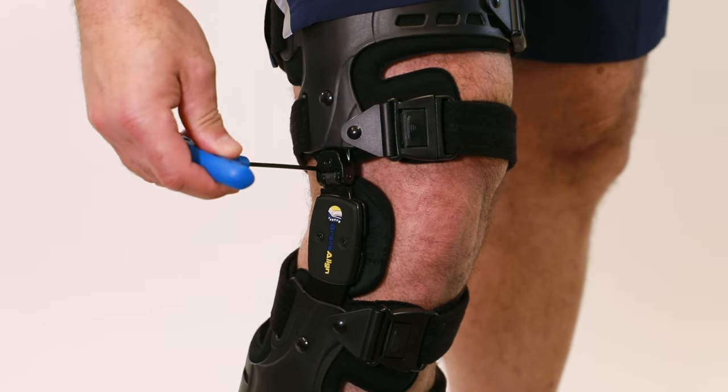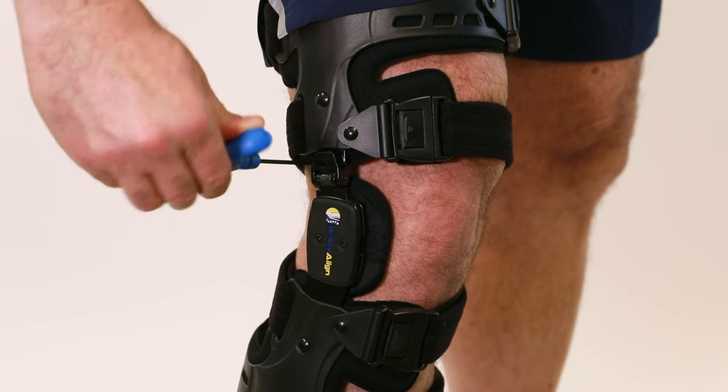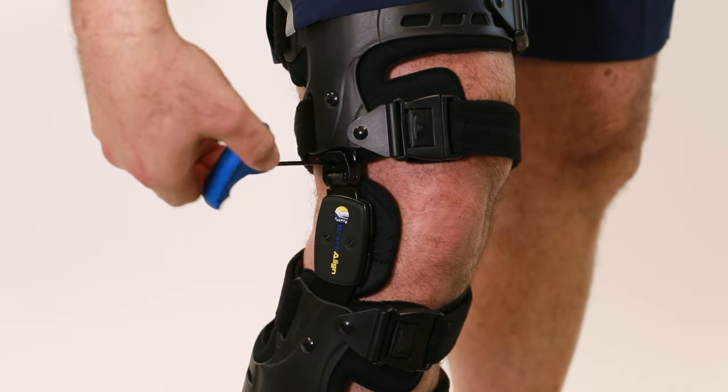If you do need to make adjustments, use the adjustment tool and place it in the slot just above the hinge. Turn 90 degrees clockwise for lateral or outer knee pain, or 90 degrees counterclockwise for medial or inner knee pain.